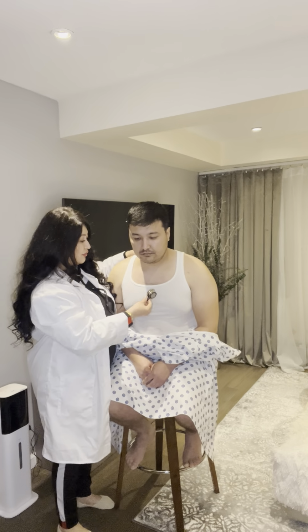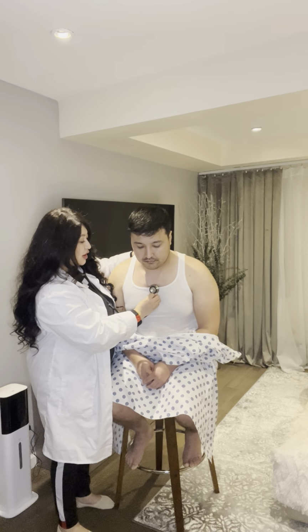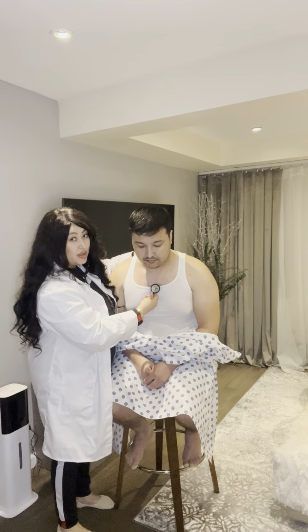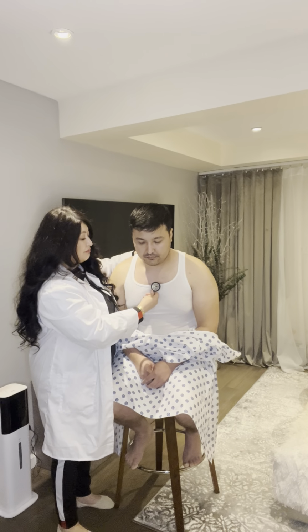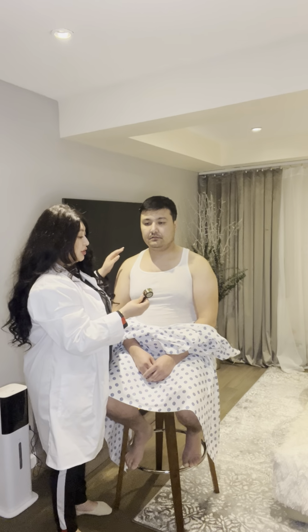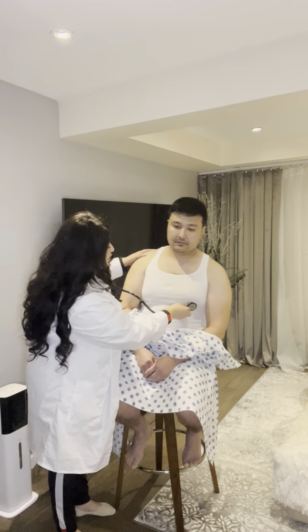Can you lean forward? Diaphragm and bell. Now I'm going to listen for the mitral murmur with the bell. You're going to hold on, lean to the left.